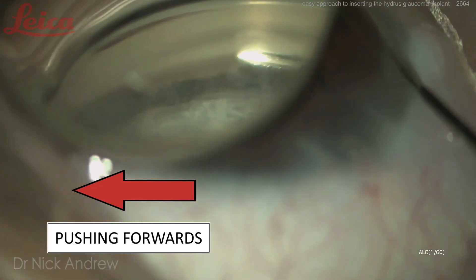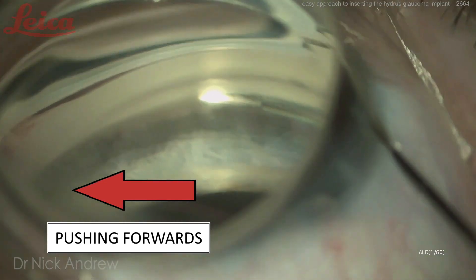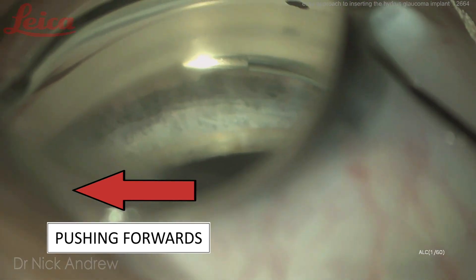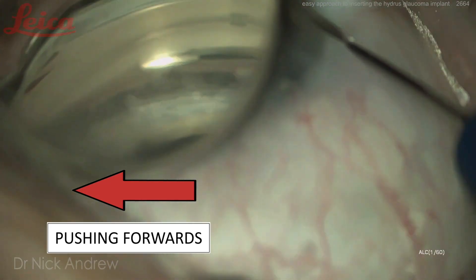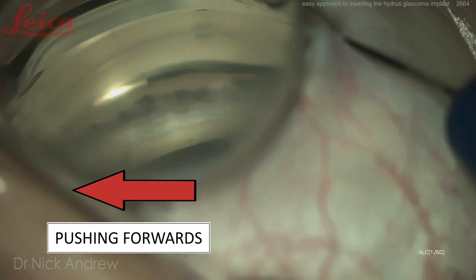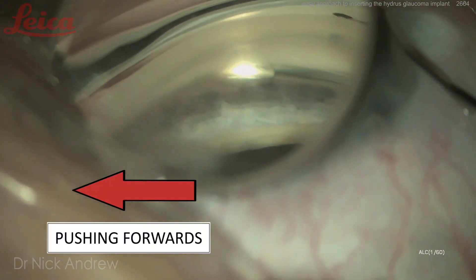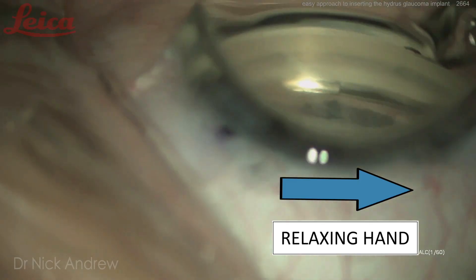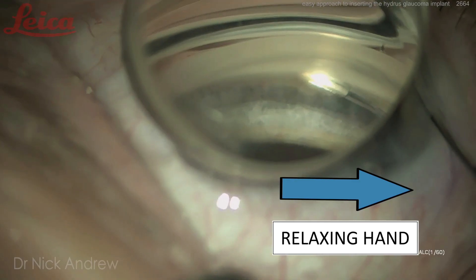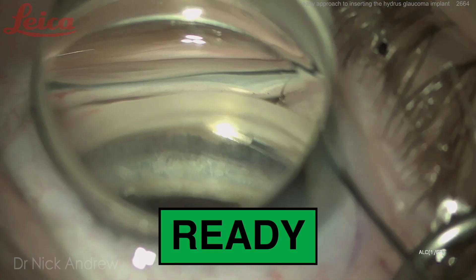Pushing forwards, I'm trying to embed the distal one third of the Hydrus injector tip into Schlem's canal. I'm wiggling the tip up and down, making sure the Hydrus injector is well seated in Schlem's canal. Now relaxing the hand — you'll see the eye retract right back to a neutral position. Pushing forwards to get a little more seating, then relaxing the hand again. The eye comes right back around. Now I'm ensuring there's no outward pressure, the hand completely relaxed, no deformation of the limbus — and now I'm ready to implant.